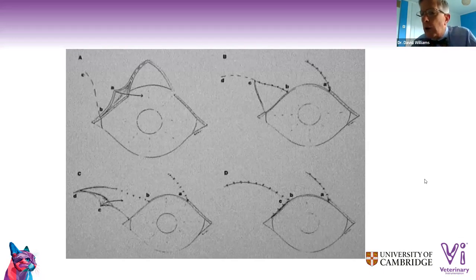Sarah, good question. Do I always clip the eyelids prior to surgery? Well, no. I didn't with a surgery yesterday. If there's only a little bit of hair there, then I really don't. And I think some people say that clipping the hair then makes it irritating when the hairs come back in. If you've got a really fuzzy, fluffy dog with lots of hair on the eyelids, do clip it. But if you've got an animal with relatively little hair on the eyelid edge, then I wouldn't clip.